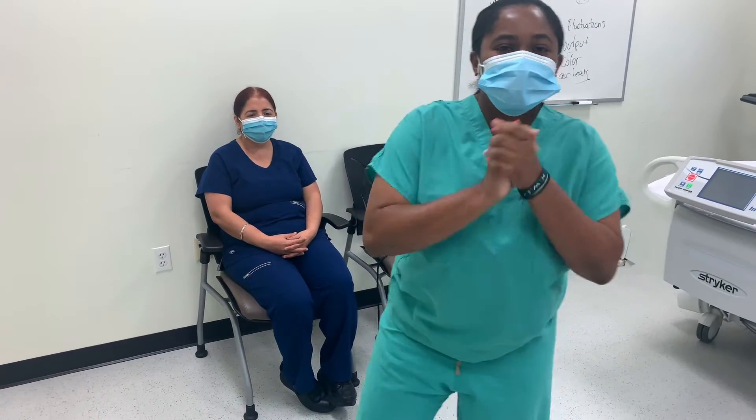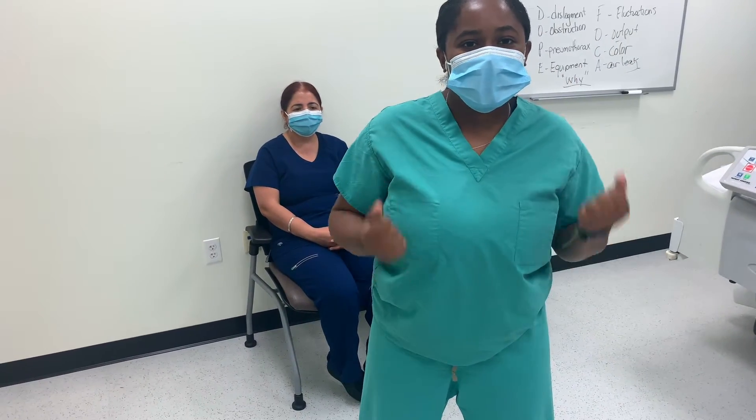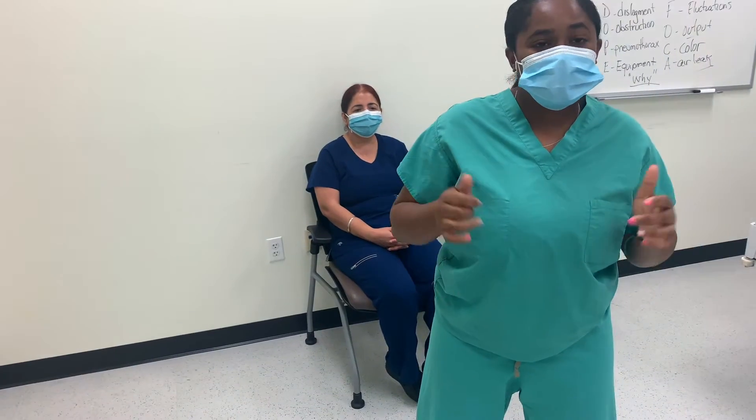Hi guys, how are you doing? So for today's video, I'm just going to go ahead and review how to take a manual blood pressure.